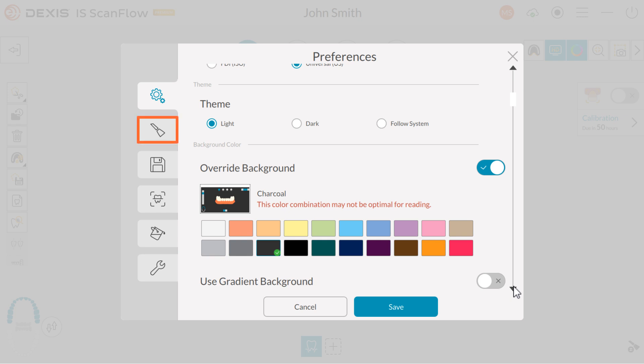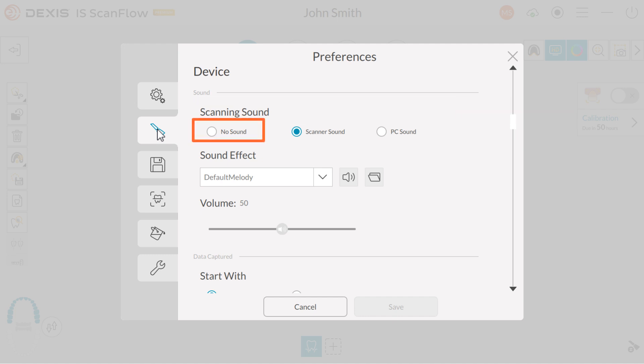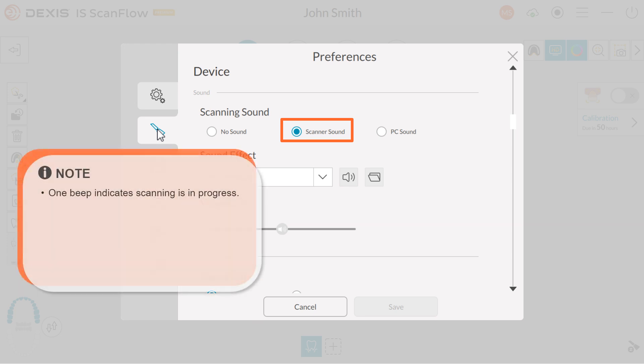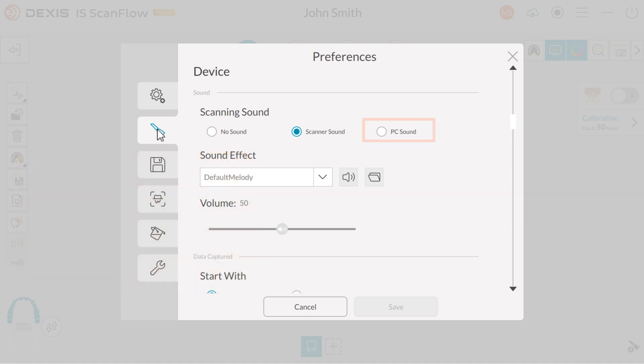Next, click the Device tab. Under scanning sound, you have three options. Select no sound if you prefer not to hear a sound while scanning. Scanner sound: if enabled, a beeping sound occurs each time a scan starts and stops. One beep indicates scanning is in progress. Two beeps indicate the scan has stopped and you must rescan a previously scanned area to begin again. A single beep also indicates you have successfully captured a buccal bite while capturing the patient bite. PC sound: select to have a sound continuously play through your PC when you are successfully scanning. If the sound stops, scanning stops and you must rescan a previously scanned area to begin again.